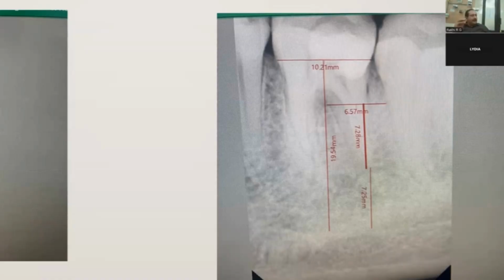Then grafting it with your bone graft, whether it's going to be PRF mixed with bone graft or a sticky bone, whatever it is, we'll see after opening that area and seeing the condition of the bone. Then placing a membrane over it will definitely help with some amount of augmentation. Because this tooth has acute infection, slight mobility is present there. This area had a periodontal abscess, which would have taken away much of the bone as well. So bone augmentation is also necessary here.